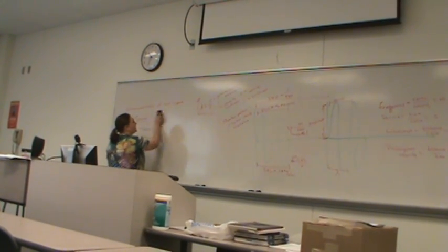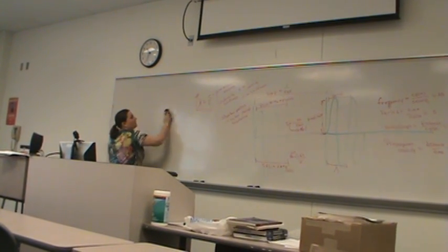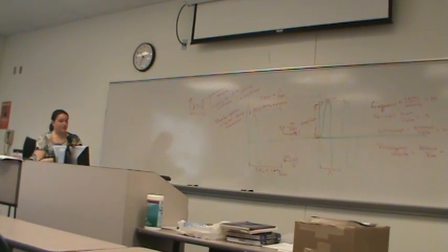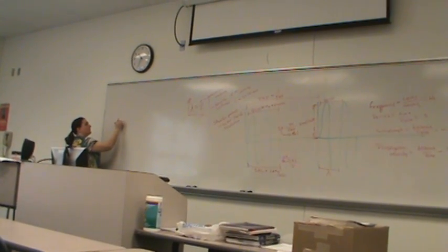Something else related to this whole idea of pulse wave and sending out all these pulses and creating these beams is this idea of frame rate.